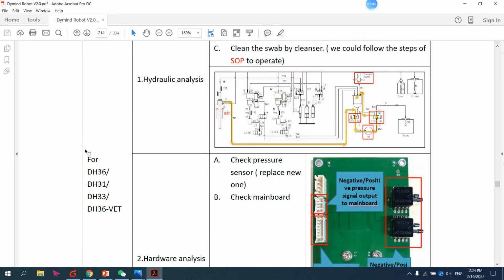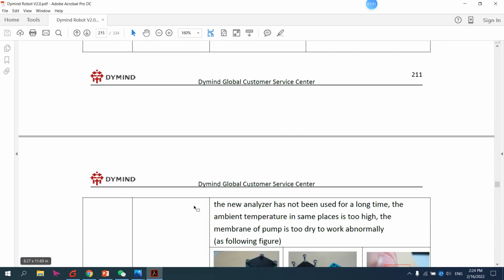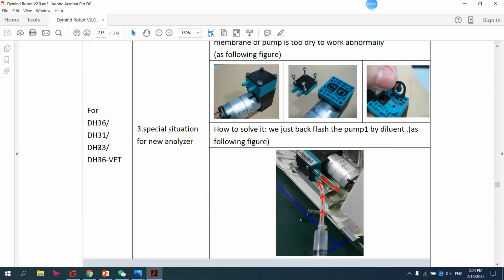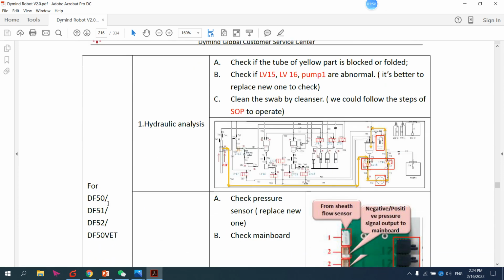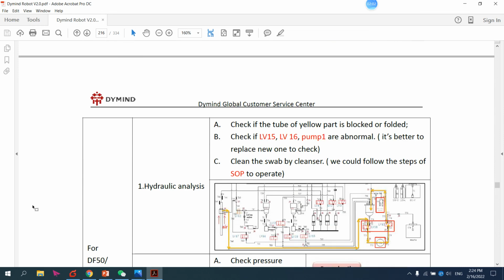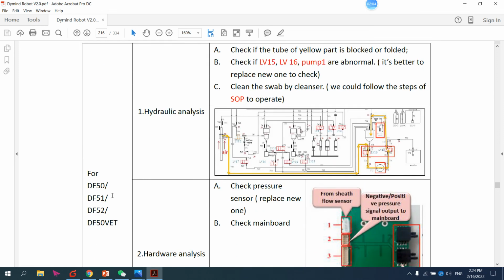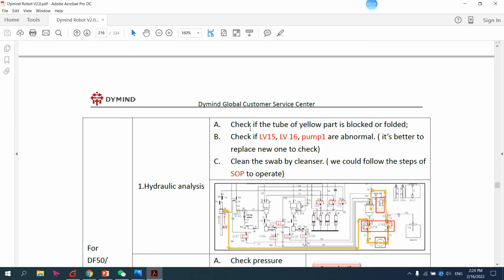Remember, check your analyzer model, whether your analyzer model is DH36, 33. These are the analyzers, right? Each analyzer has a different solution here. For example, this is for DF50, 51, 52. These are the solutions.